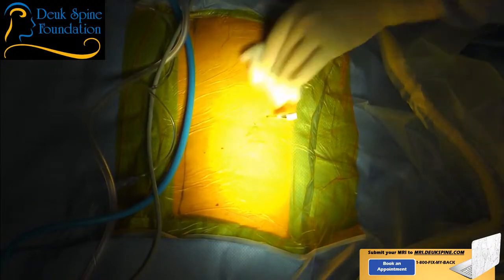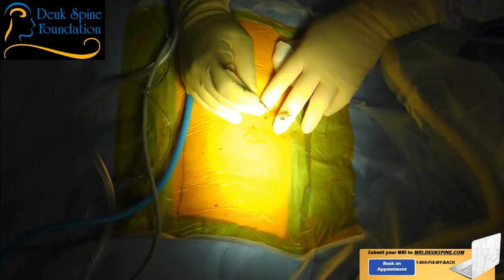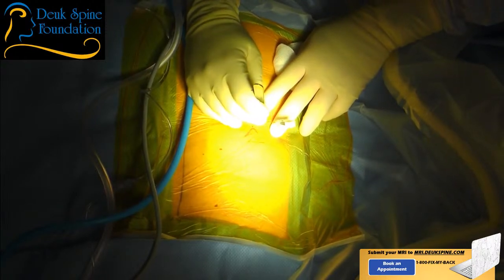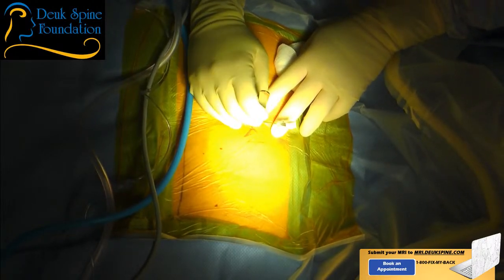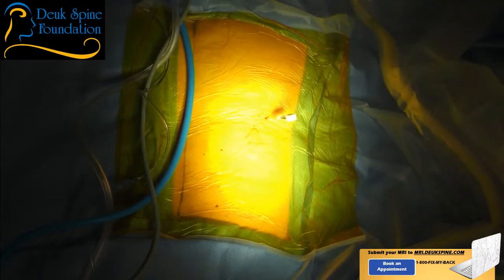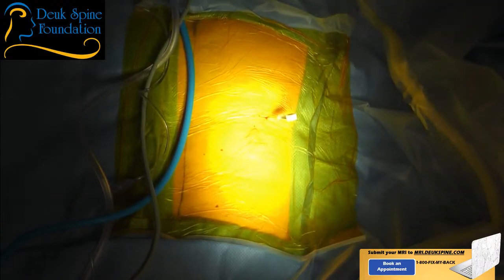So let me know if it hurts, okay? We're going to make our incision now. And the incision we're making is going to be 7 millimeters. That's it. The whole surgery is done with a 7 millimeter incision.